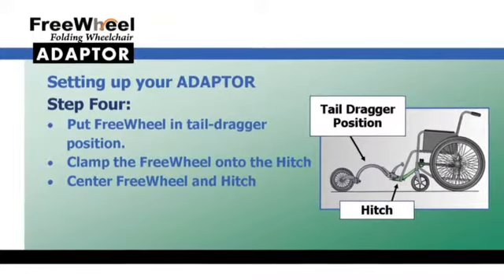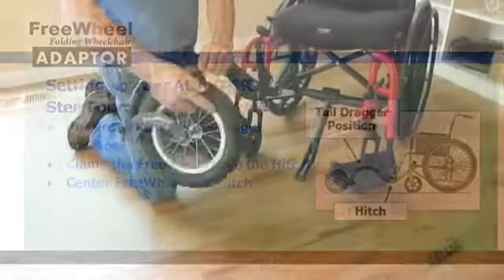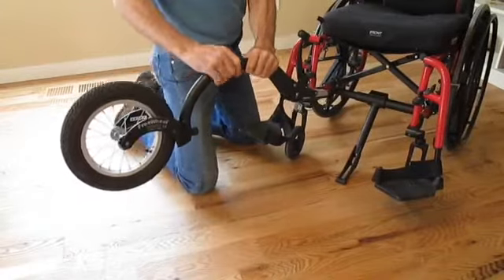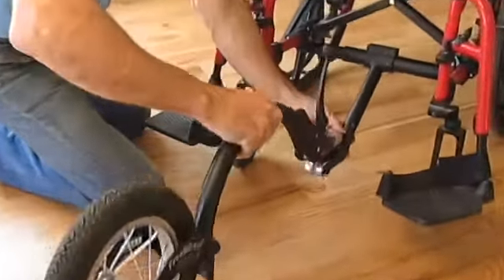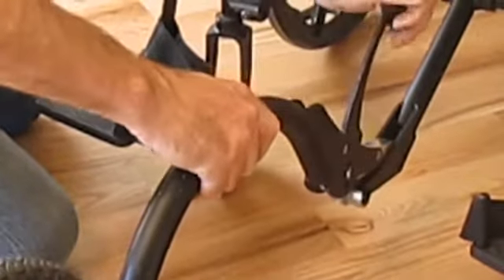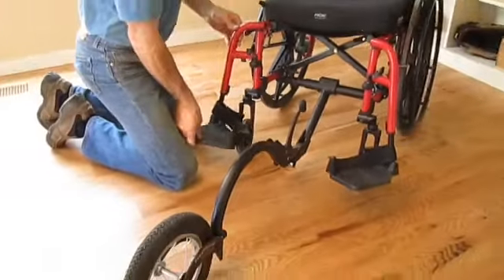You are now ready to attach the FreeWheel to the adapter hitch. Put the FreeWheel into the tail-dragger position, and then lifting the hitch, clamp on the FreeWheel. When it is done, you will want to make sure the FreeWheel and the hitch are centered in relation to your wheelchair.